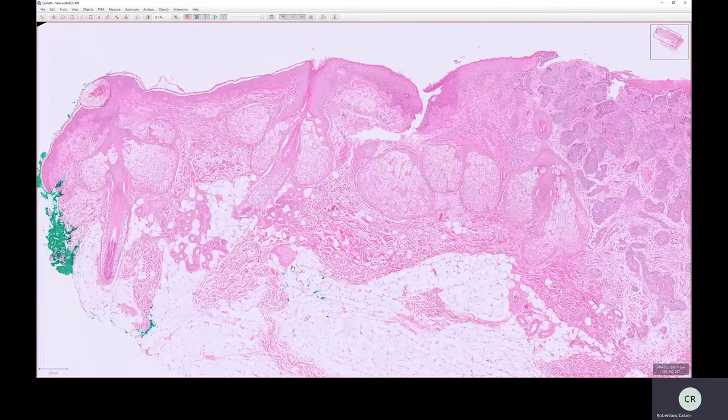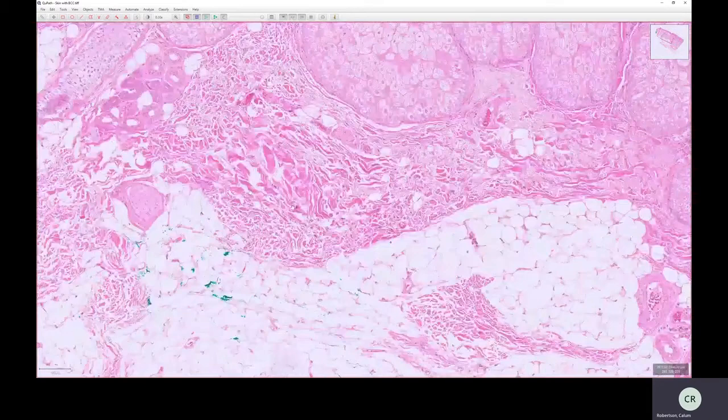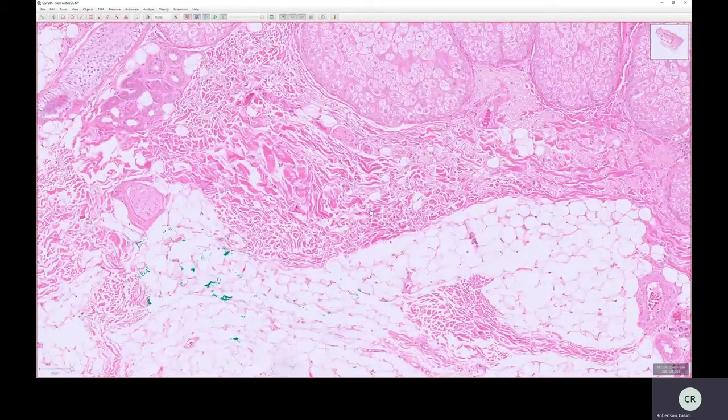The only last thing really to cover is the stuff in between all this other stuff. So we've covered the epithelium, the squamous epithelium, the glandular epithelium. This is a hair follicle actually, which is a modified form of squamous epithelium. This is glandular epithelium. But between all of this stuff, between the nerves and the squamous epithelium and the glandular epithelium and then the blood vessels, is the connective tissue. And this is connective tissue.